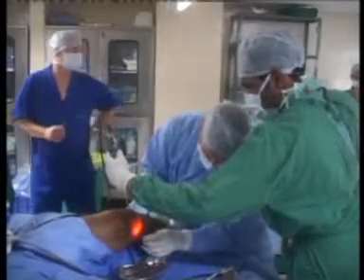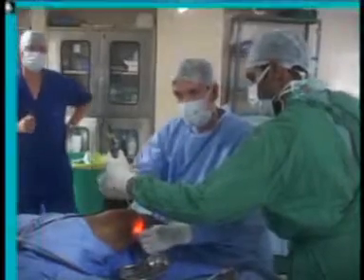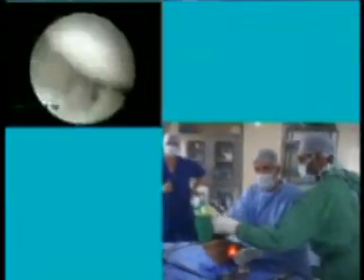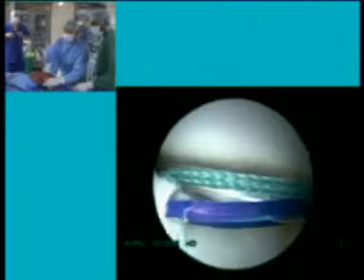Dr. Wolf Peterson, can you hear us? Yes, I can hear you very well. Can you tell a little bit of what you're doing? This is a double bundle ACL with a meniscal tear that you're repairing, are you? Yes, I have already done a meniscal repair of the lateral side.